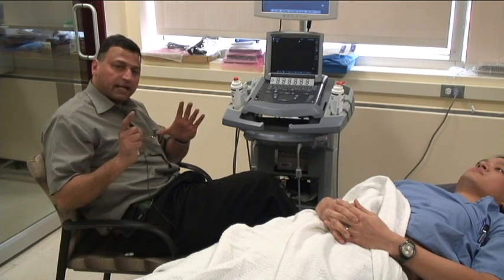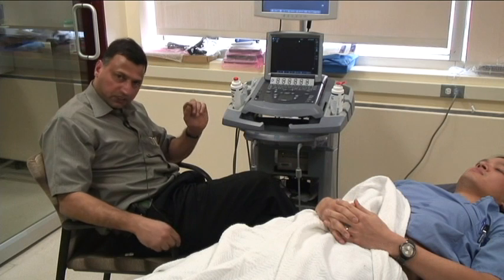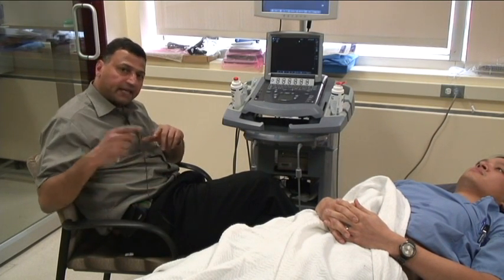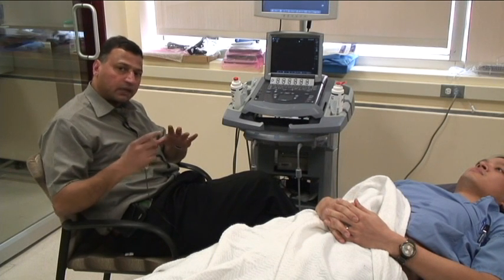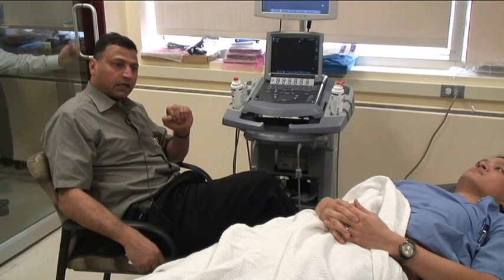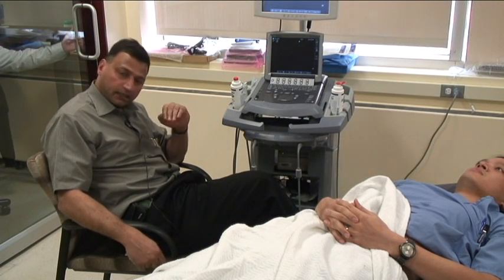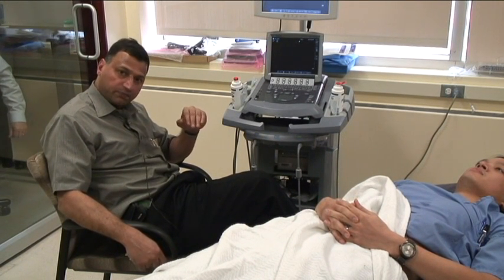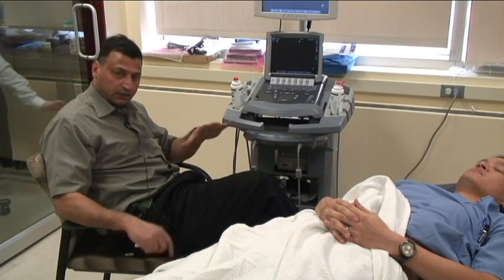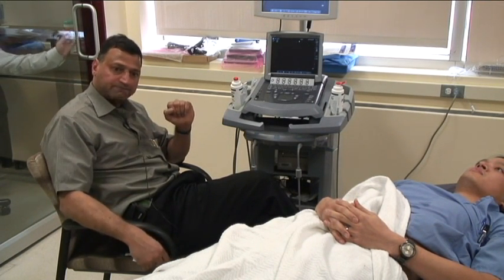Remember, this is not absolute. It's plus or minus 2 at least. And particularly in a mechanically ventilated patient, it might not be as good as in a spontaneously breathing patient. Another caveat, you can, as you know, have an elevated CVP for various reasons, and yet be fluid depleted, as in all cases of right side disease. We talk about changes of IVC with respiration.